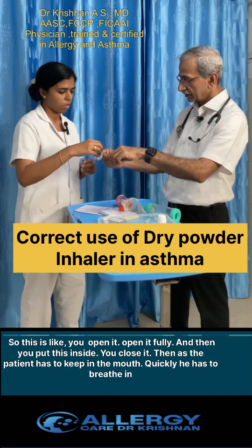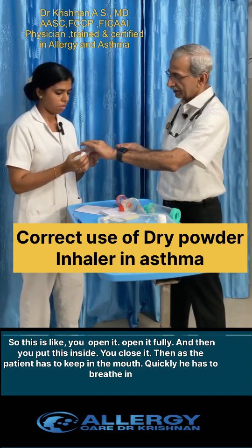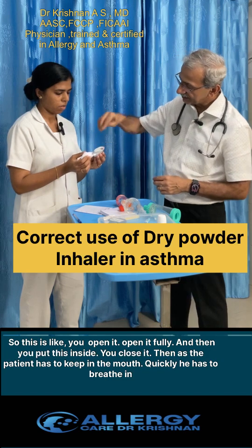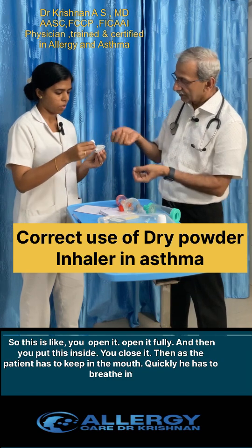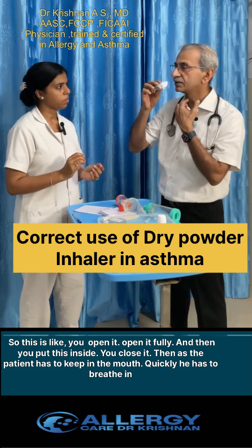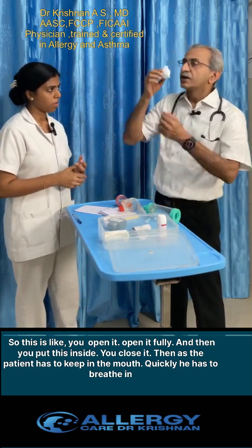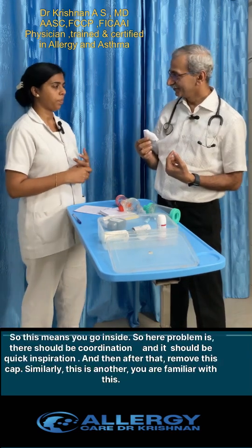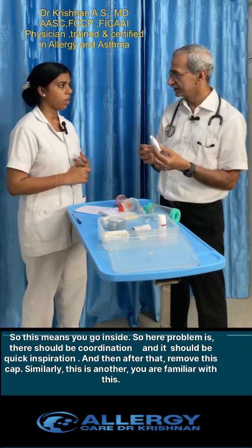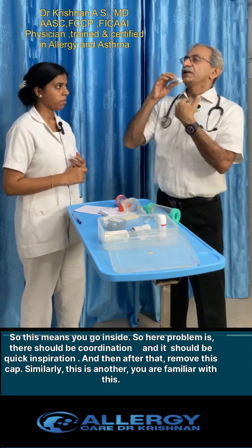You can open the rotahaler fully. Then we put the rotacaps inside and close it. As a patient, you keep it in the mouth and quickly breathe in — the medicine will go inside. The key point is that the breath-out should be done properly first, and then breathing in should be fast.